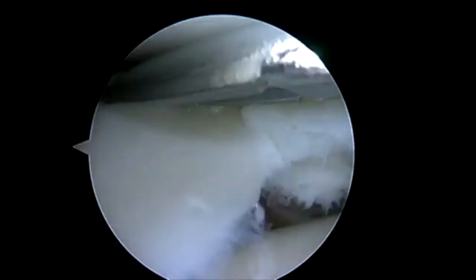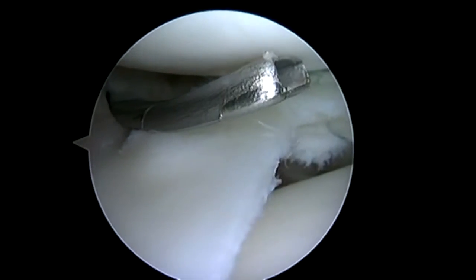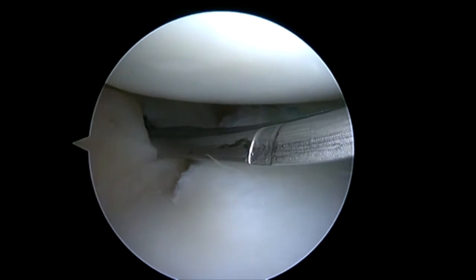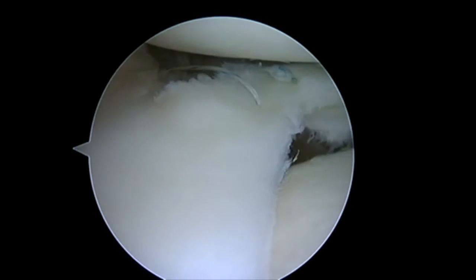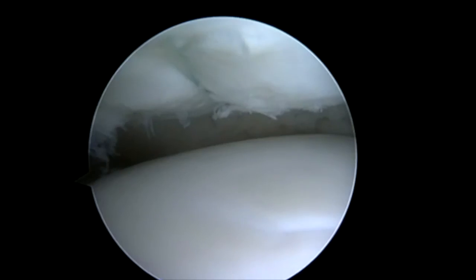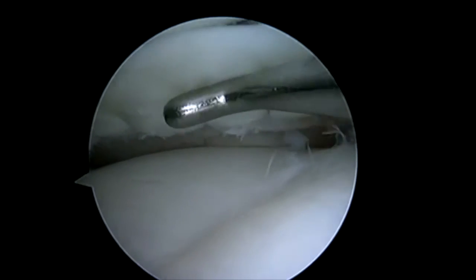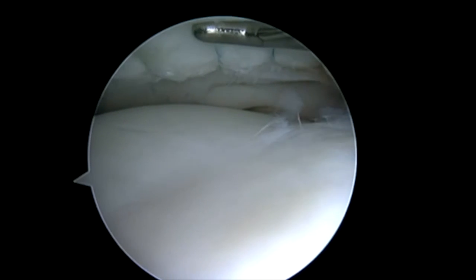You can just see the knife lifting up the meniscus here and incising just below the meniscus at the capsule. I'll bring the upper jaw in, and then I'll introduce the lower jaw beneath and pass a suture around the meniscus so that I can tie this over the capsule. So here we've passed our suture, and we can do a nice secure tie of the anterior horn of this meniscus back to our capsule. So now we've got a completed, anatomic repair of a large bucket handle tear of the lateral meniscus with an all-inside technique utilizing a NovaStitch Plus device.